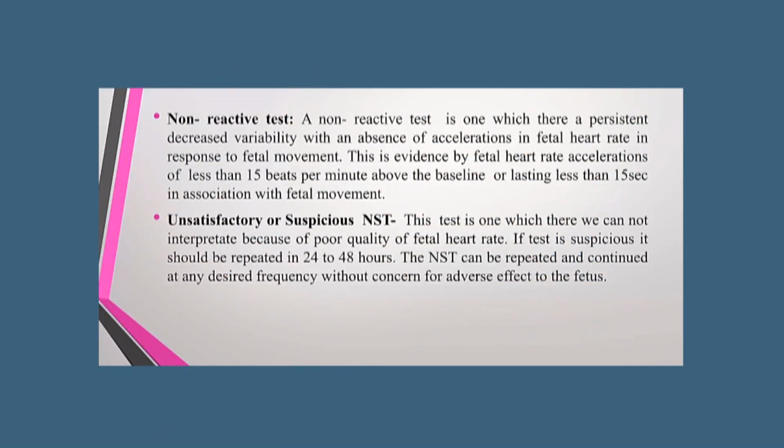A non-reactive test is one in which there is persistently decreased variability with an absence of acceleration in fetal heart rate in response to fetal movement. This is evidenced by fetal heart rate acceleration of less than 15 beats per minute above the baseline, or lasting less than 15 seconds, in association with fetal movement.